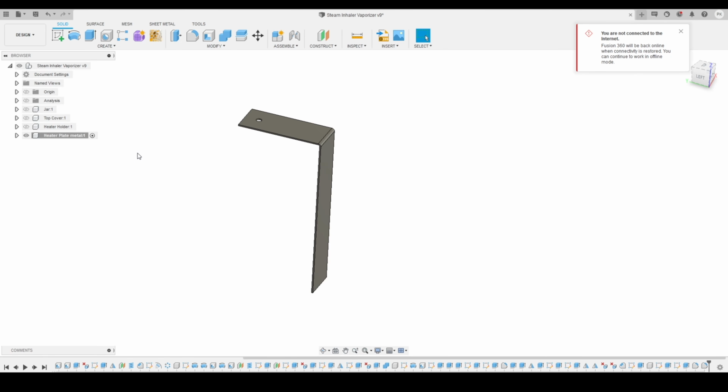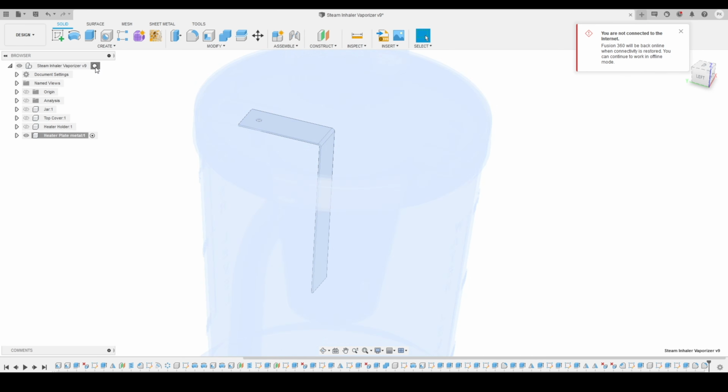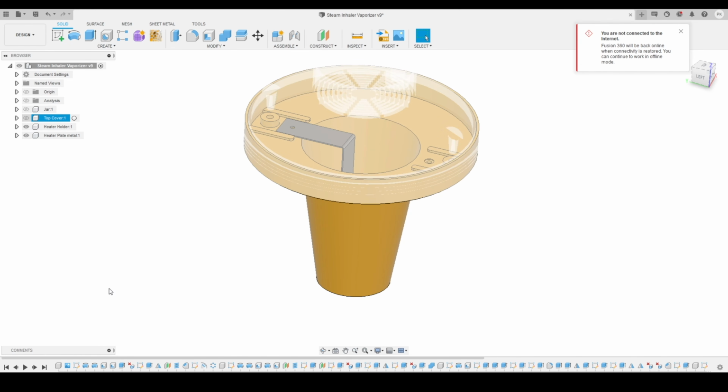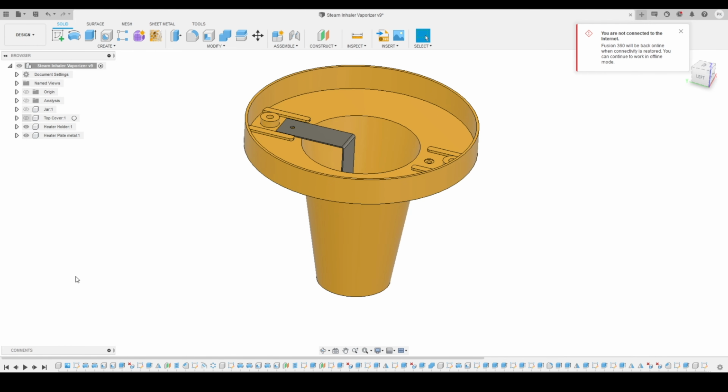Now what I'm going to do is turn on the heater holder again, and mirror this plate on the other side. So there will be two plates on one heater holder. Here you can see I have just turned on the top level assembly, and after that you can see how it is looking. This is the heater holder plate that looks something like this. Here you can see I have just turned on the top level assembly and you can see all the components.